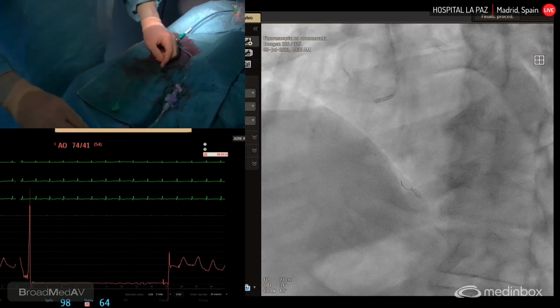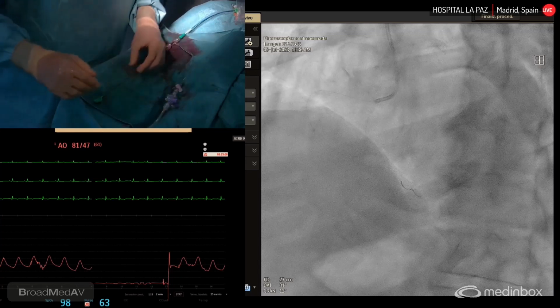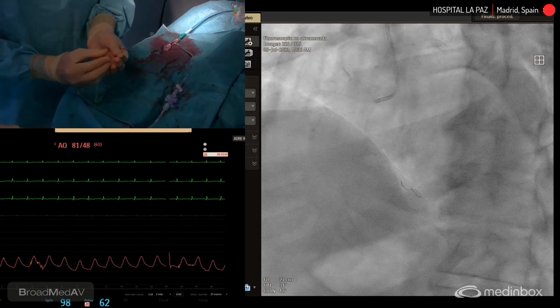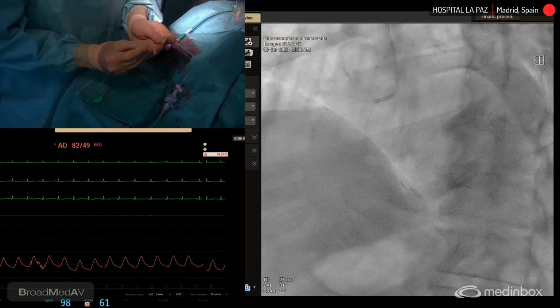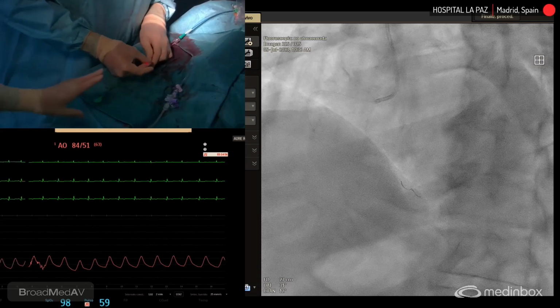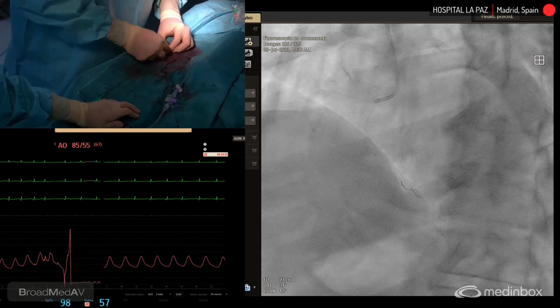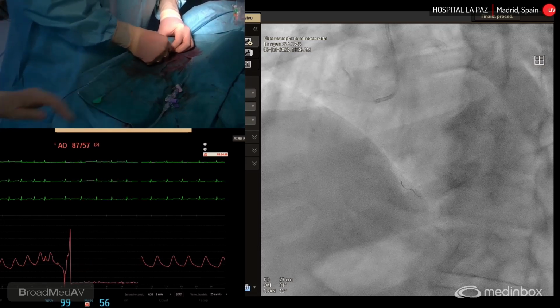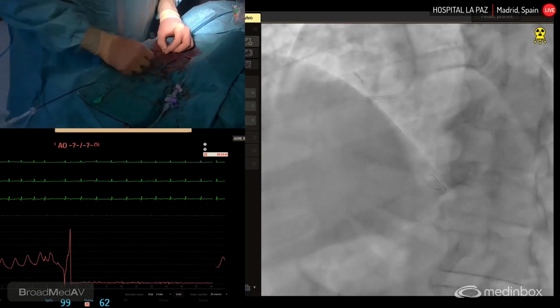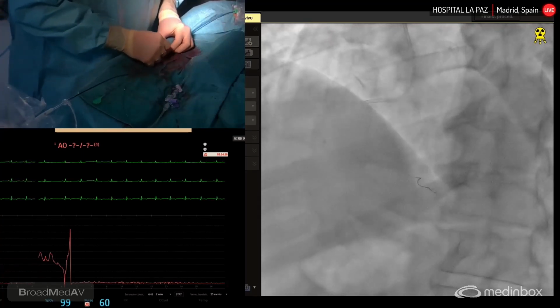Okay. One more question, Danny? No, there are no more questions. I would like to know the opinion of the audience about how many operators would have decided to use only a drug-eluting balloon. Yeah, this is a good debate.